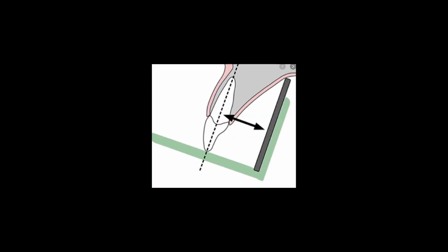Got the basics of the bisecting angles and whatnot of the intraoral film. I know it's a bit tedious, but I'm certain you get questions on this, because you have to understand when you get things elongated and when you get things shortened. And the answer to it is that the parallel beams that are coming at you, the X-rays from this source that has been collimated down the barrel of the gun, that tube on the X-ray machine, it's taking millions of tiny bullets and shooting them in one parallel direction at you. Well, it's still a point source, but the collimator beam is there to try to reduce it, to try to make it from a tiny point source.